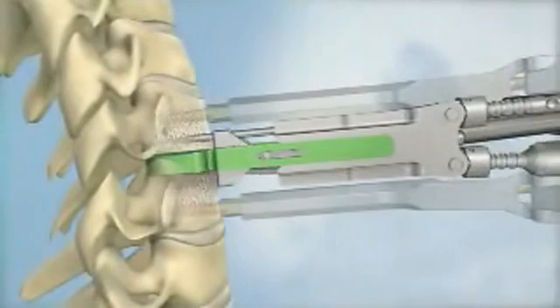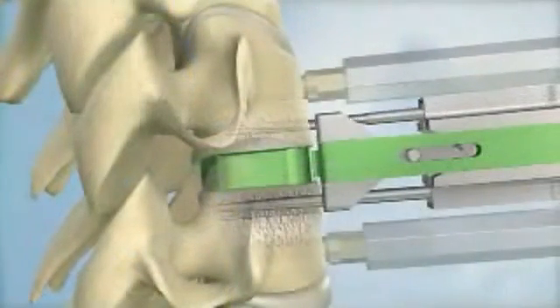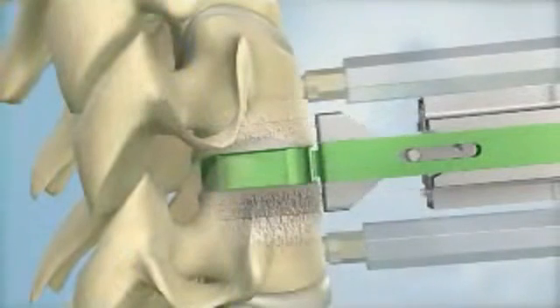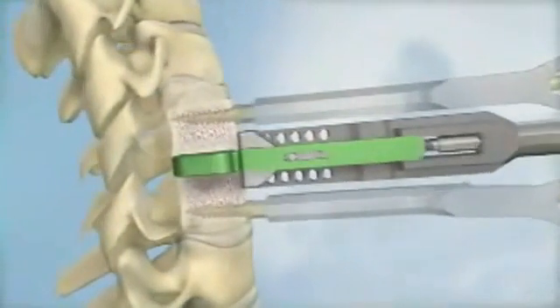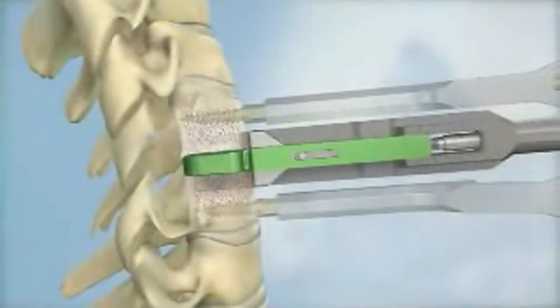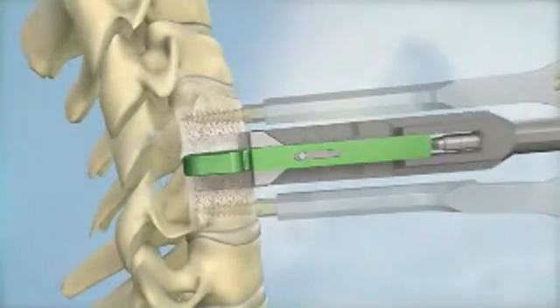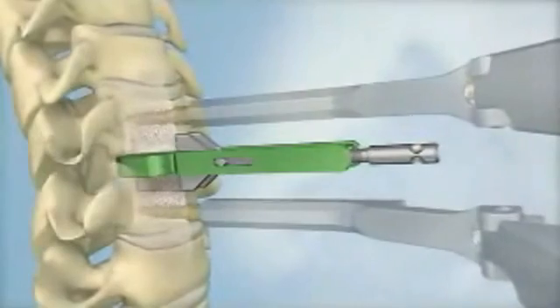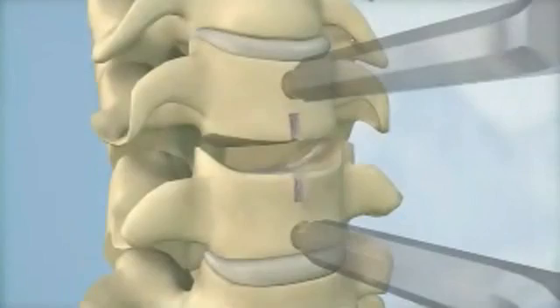The keel channels for the ProDisc-C implant can be prepared using either a milling technique or a chiseling technique. In the milling technique, a milling bit is used to create the channels for the ProDisc-C keel. The chisel technique utilizes two chisels to create the keel channels. First, the primary chisel is inserted over the trial and advanced into the vertebral bodies. The step is repeated with a secondary chisel to remove any remaining bits of bone from the keel channels. Both the milling and chiseling instruments are designed to ensure that the final placement of the implant precisely matches the placement of the trial.